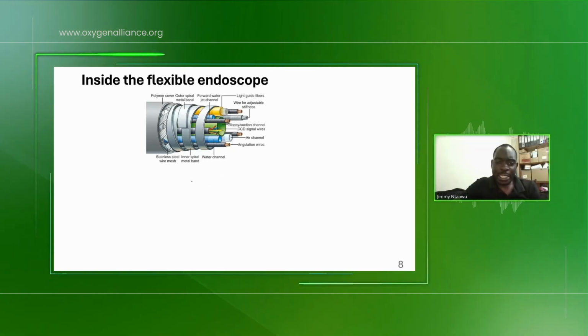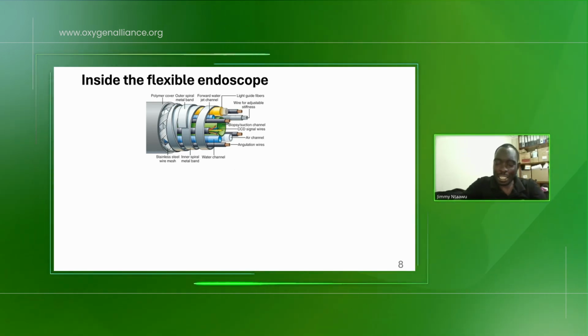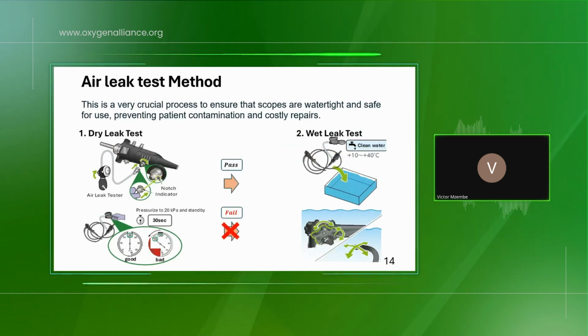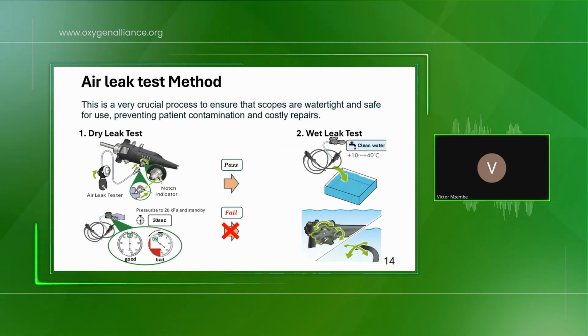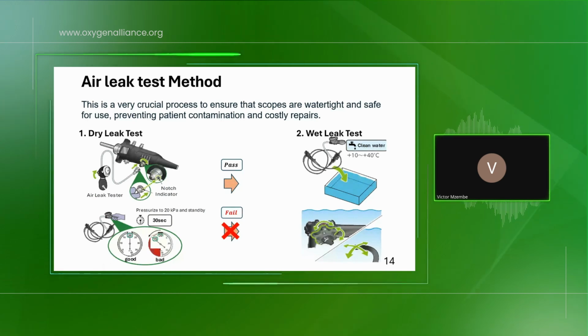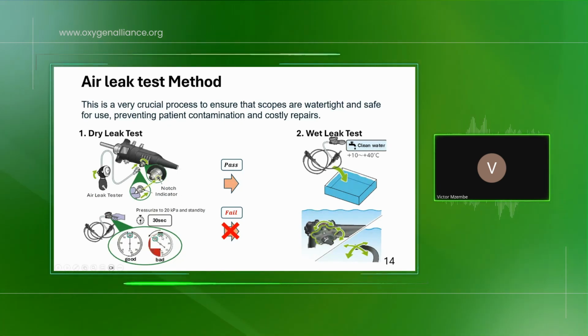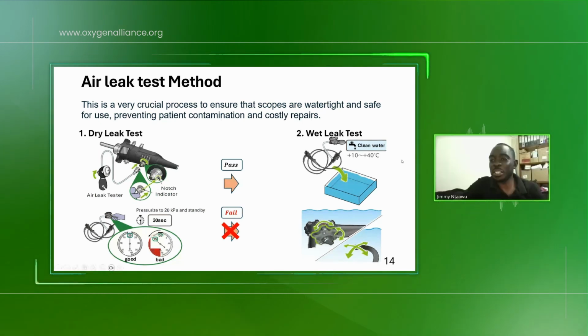You do a leak test at degrees? I don't understand the question. It's on the leak test presentation. I think I saw somewhere the temperature range, which is +10 to +40 degrees Celsius. So the way I understood it, you mean this or this? Yes, yes. This is for the safety of the scope.